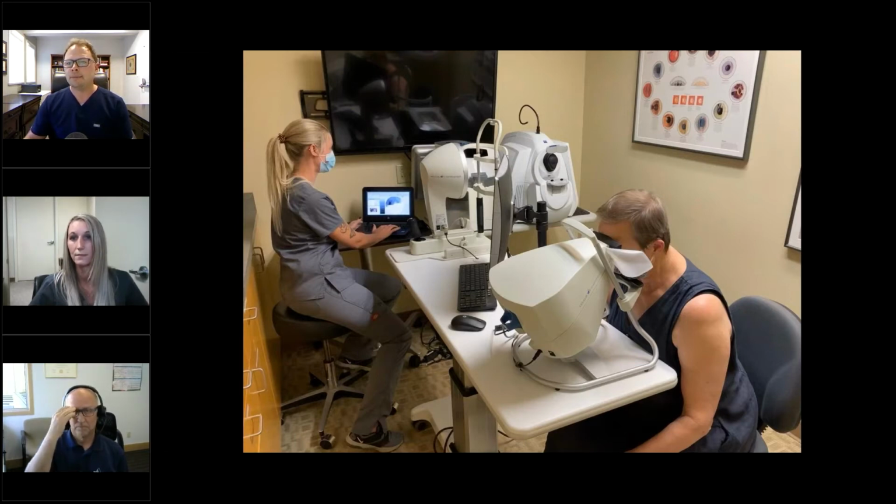So I was asking myself in preparation for this lecture, how do we do it? If I were going to tell my friends, this is what you need to do. I think for me, the key thing to make this work has been that the moment I know I need a visual field, I notify the staff. On-demand visual field. I page them. I use whatever messaging system I have at my fingertips.